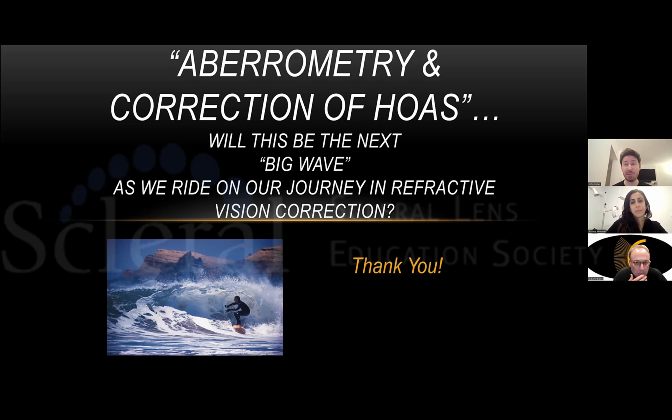So something that I may have accepted by saying, hey, that was good enough. They're doing great. The lens looks good on the eye. It's not causing any issues. Sure, it's got a little tiny bit of movement or rotation, but I don't care about that. That's fine. They're out the door. In this, it matters. You cannot accept any sort of movement or rotation of the lens. And that can make this a little bit challenging, but those other systems can certainly help solve some of that. But really, you've got to take your level of acceptance and bring it up a notch, and then you go pretty well from there.